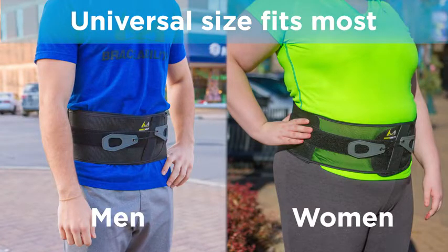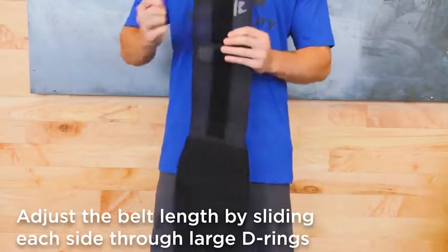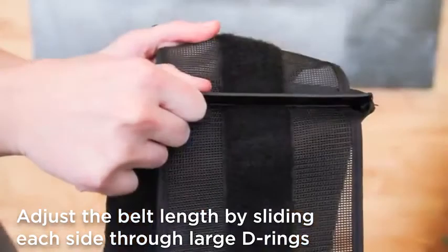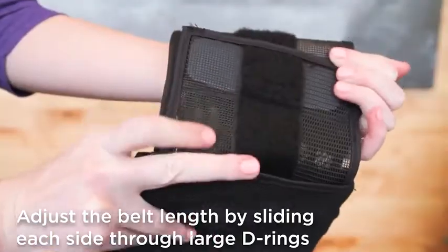Thanks to its one-size-fits-most design, you can easily adjust the length of the belt. Just slide the belt through the large D-ring until your desired length is achieved. Make sure to adjust the right and left sides equally for optimal support.